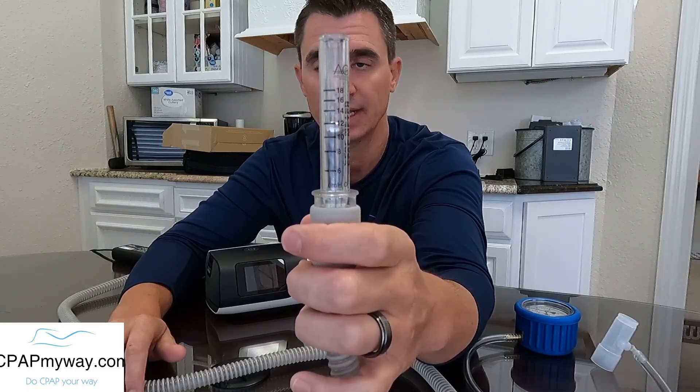If you're getting a reading that is low, there's a chance that you have a setting in the machine turned on. For instance, in the AirSense 11 that would be EPR — your exhalation pressure relief setting. In a Philips machine it would be Flex; Luna is ResLex; other brands have similar settings. Those settings reduce the pressure when you exhale, but they can also leave the pressure reduced when you're checking it on a manometer, because there's enough resistance on the manometer that the machine thinks you're exhaling and drops the pressure, making the gauge read a little low.